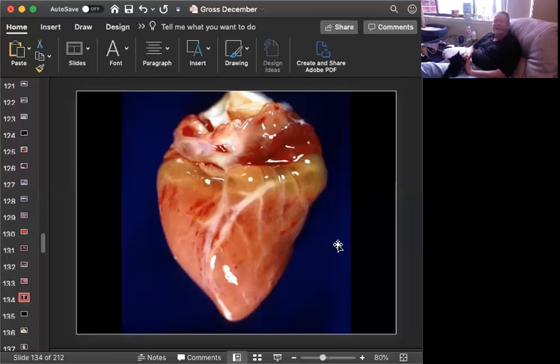I've had residents who, without looking at the gross lesions, might have received these slides as part of a necropsy in a jar, and they want to call these myxomas because there's such degeneration. There's almost no recognizable fat. It's all this bluish material. Whenever I hear somebody talk about myxoma in the heart of the goat, it's like, back up. Let's go back to the gross lesions and see if this wasn't just a starving, malnourished animal. Melting syndrome of goats, that's my name for diffuse severe serous atrophy of fat.